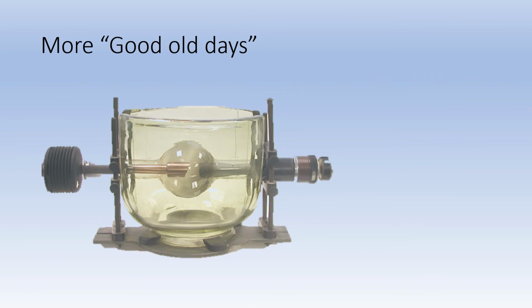It was soon discovered that restricting the beam improved images which were badly fogged. So a crude form of beam restriction was added to X-ray tubes. The lead glass bowl surrounding this X-ray tube was added as a crude form of collimator. Notice it did little to stop stem radiation not directed at the image receptor.